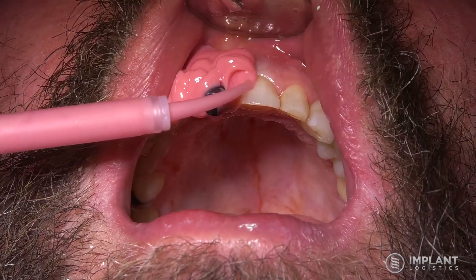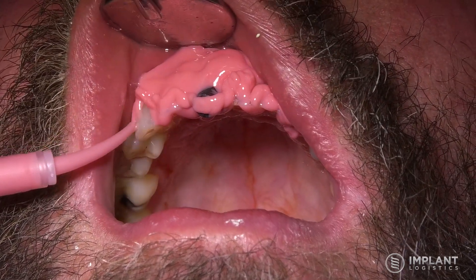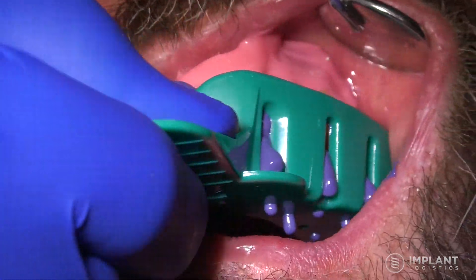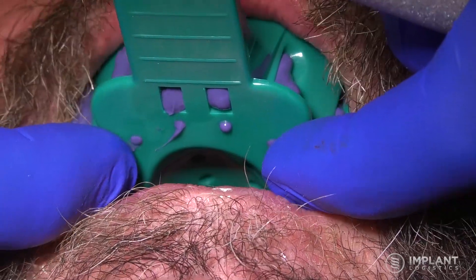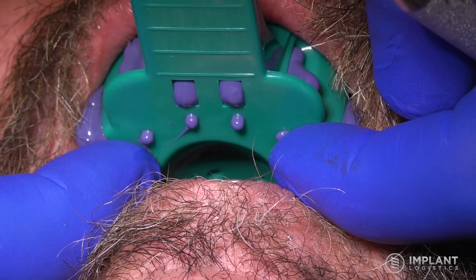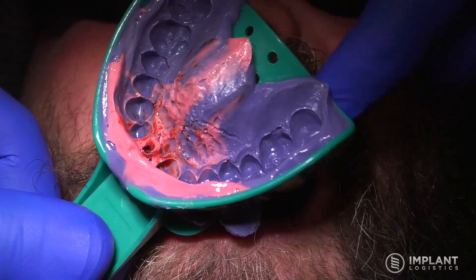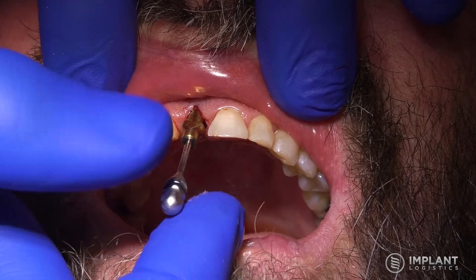You're looking at a standard impression — generally polyether or polyvinyl impression material would be the material of choice. You could do a digital impression with a different impression post, but now you're in your standard impression protocol. This particular material has a four-minute set, so after four minutes remove the impression tray. Because we took the impression the same day we uncovered the implant, there will be some blood and whatnot in the impression.